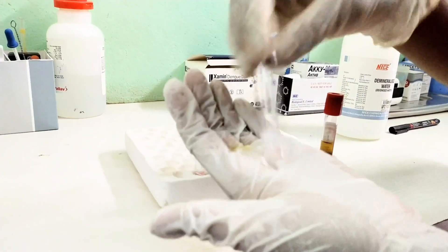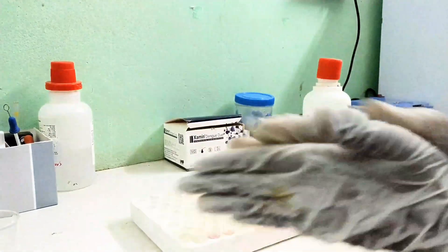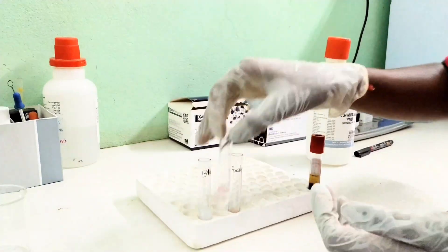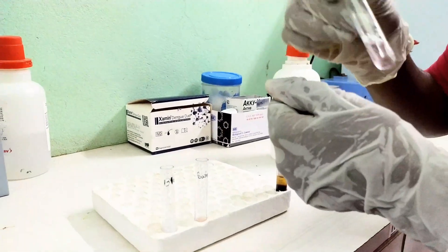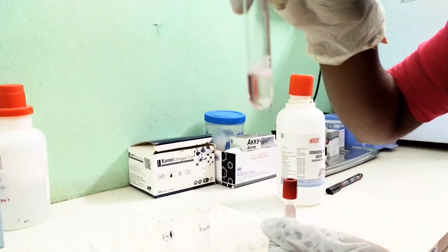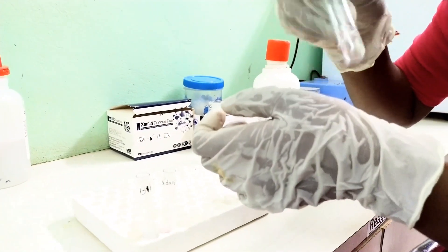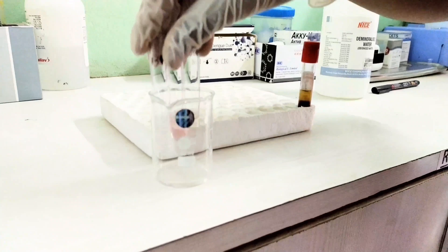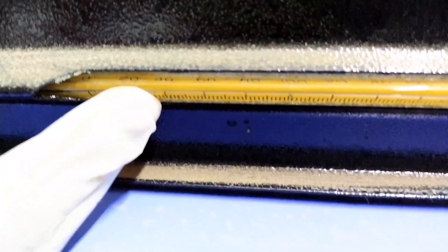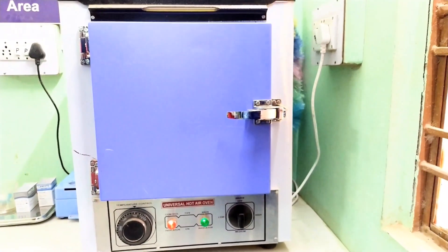Mix well using the rotating method. The color is developed after 5 minutes of incubation at 37 degrees centigrade.